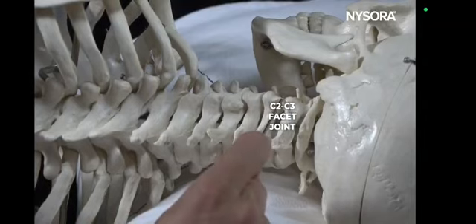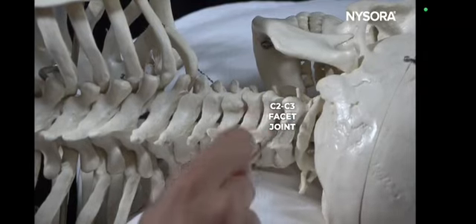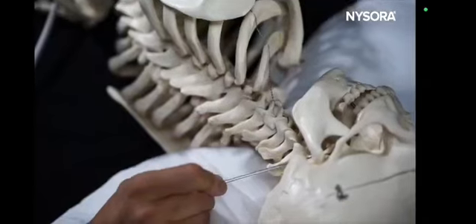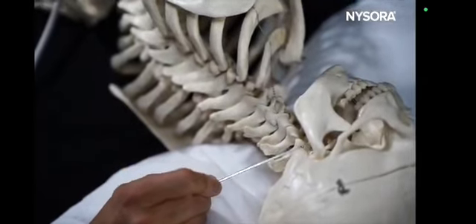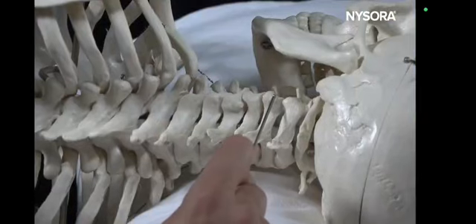This is the first joint that will be visible on the ultrasound because C1 is just a ring and it becomes very difficult to actually identify that C1-C2 joint on the ultrasound in the lateral position. So your first visible joint will be the C2-C3 joint.